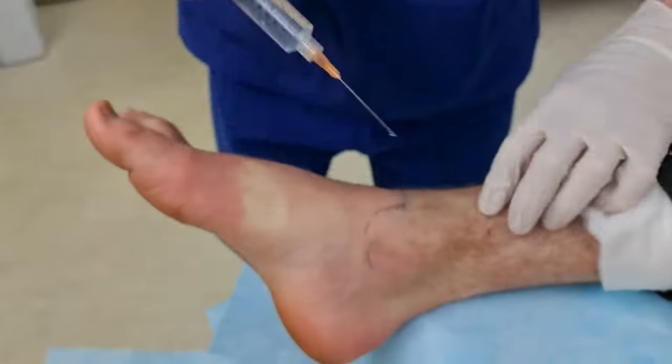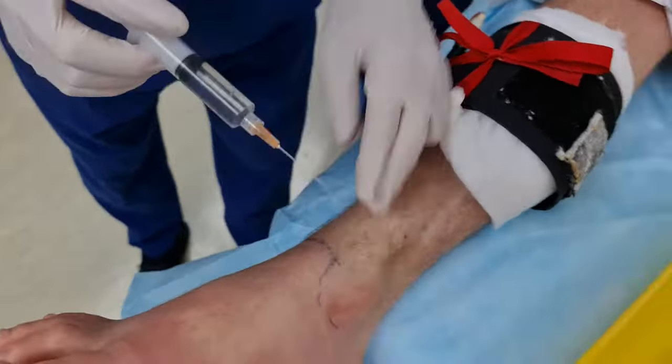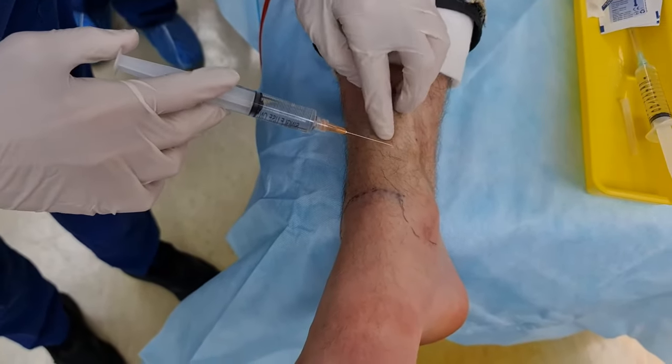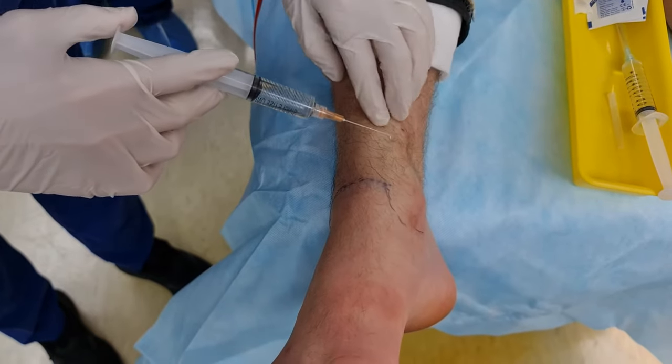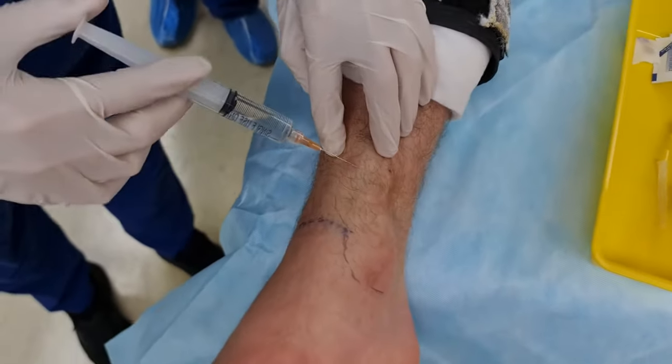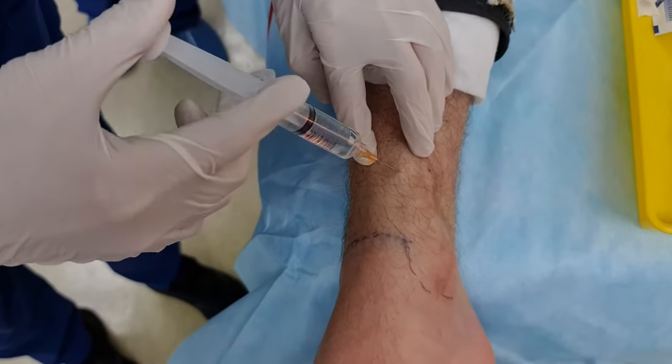Now we're going to go saphenous. Again, about two finger breadths up — runs parallel to the saphenous vein, so you don't want to get the saphenous vein. You go slightly medial of it. This one is staying superficial, so you use a little caterpillar approach here.